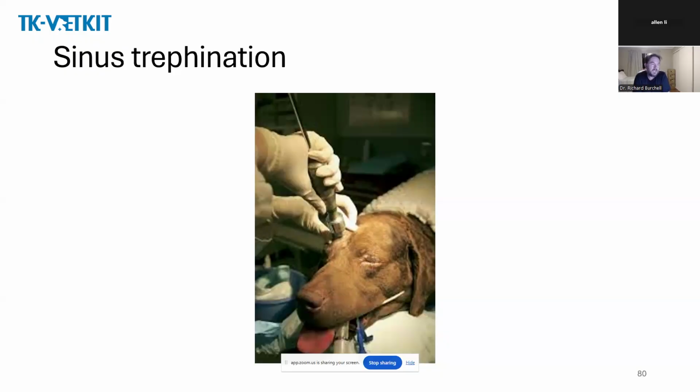And I will put it in so that only about 1.5 centimeters of the pin is sticking out, so that when you push it through the sinus, as it pops through, only so much pin can go in. Today I had the luxury of using an electric drill, which I've never used before, which made the job really easy, but it's very unnecessary. A hand drill works just fine.